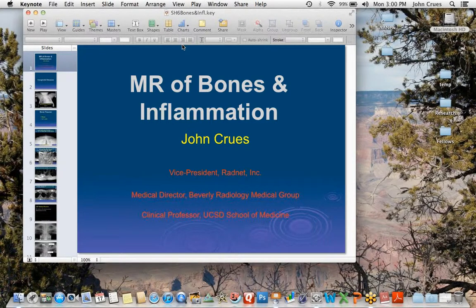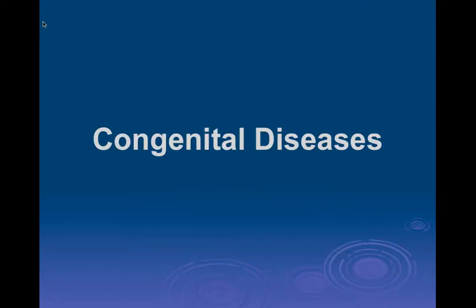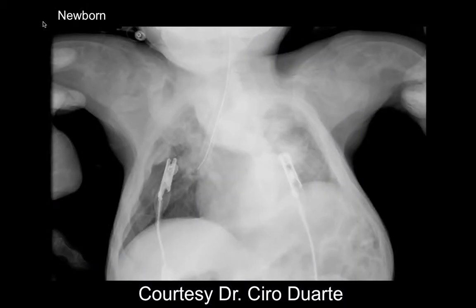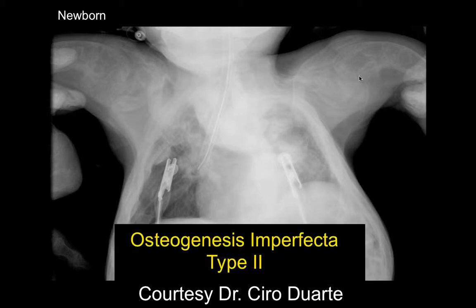Now let's talk about bones and inflammatory disease of the shoulder. Looking at this case of a frontal chest in a newborn, there's a markedly abnormal appearance to the bony structures pretty much diffusely, particularly in the bilateral proximal humeral heads. This is consistent with osteogenesis imperfecta.